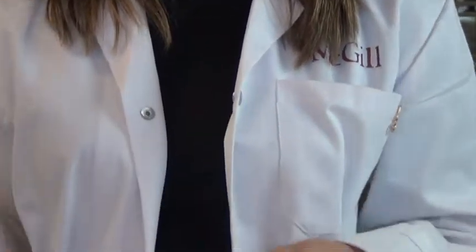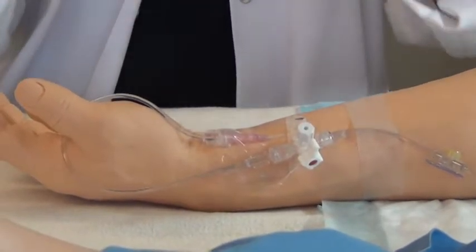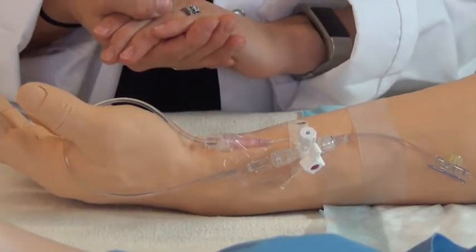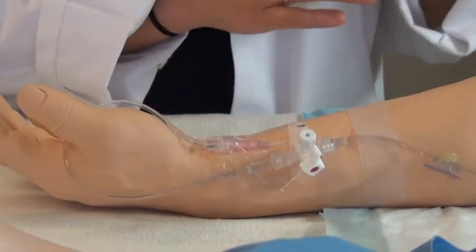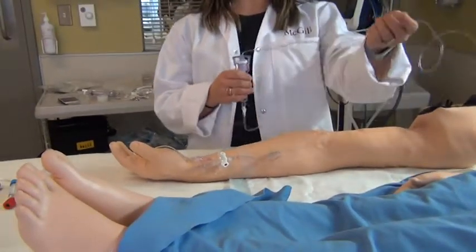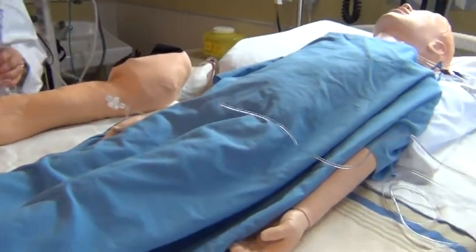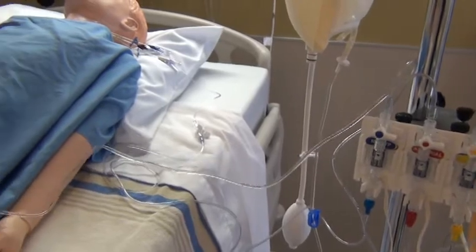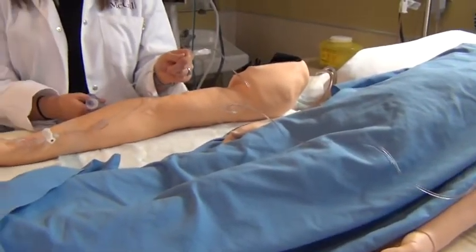So for the purposes of this video, we'll assume that I'm wearing gloves and I will preserve sterile technique throughout. What we will talk about is first how the arterial line is set up. You will see that I have the syringe attached here, and how the arterial line connects to your transducer. As you recall, we use special pressure tubing to attach our arterial line to the transducer in order to be able to sense differences in pressures.